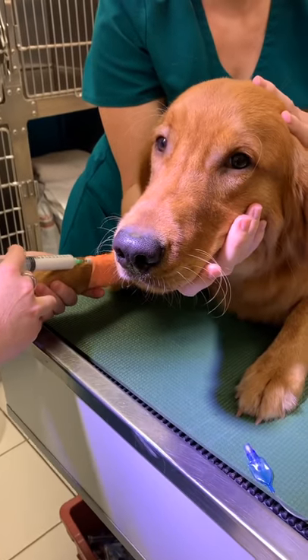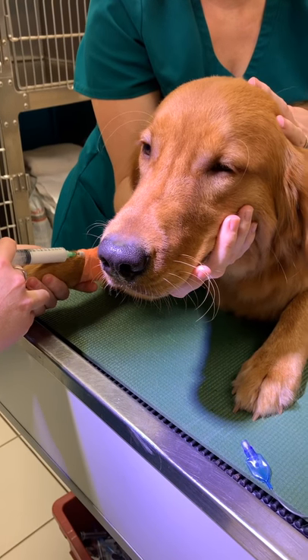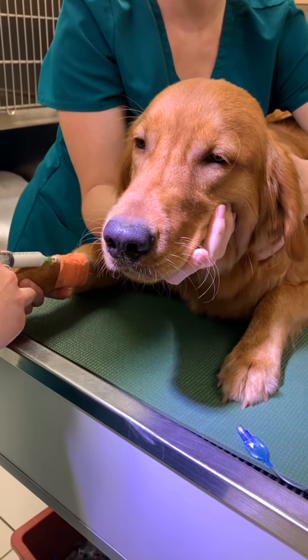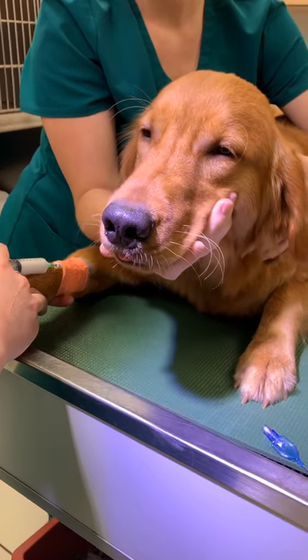So here now we're giving Ollie his intravenous propofol. This is after he's already been pre-medicated, so you can see he's already a little sleepy. But this will help to induce the next step where we'll place an endotracheal tube so that he'll be receiving oxygen during his procedure.